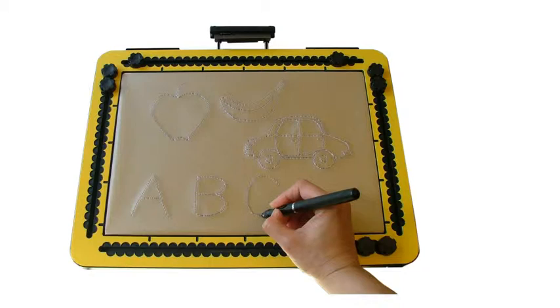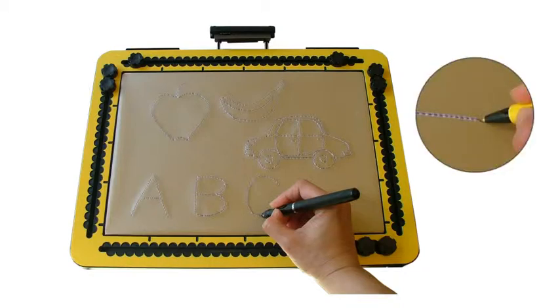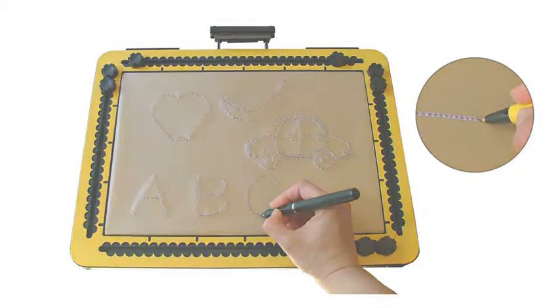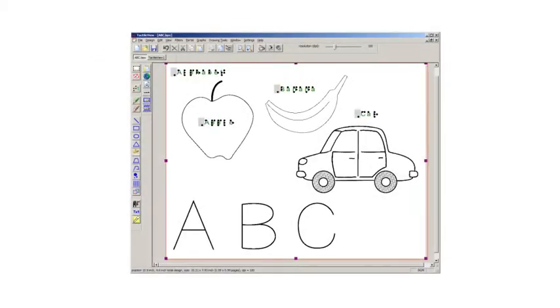A tactile image appears instantly as you begin to draw on the tablet and the drawing is also stored electronically within the software. You can even add Braille and text labels.